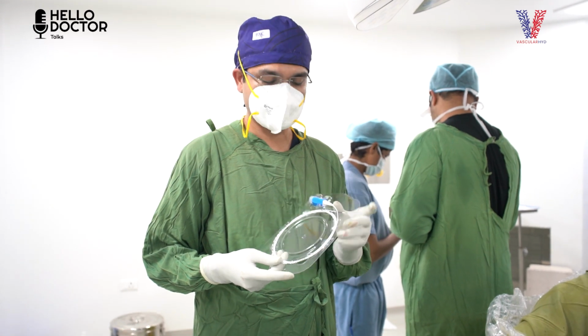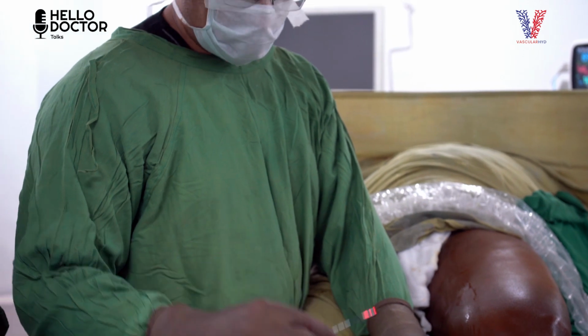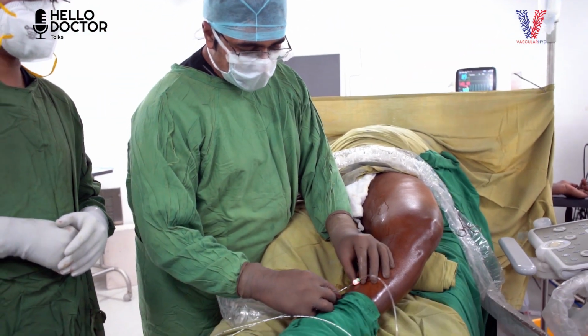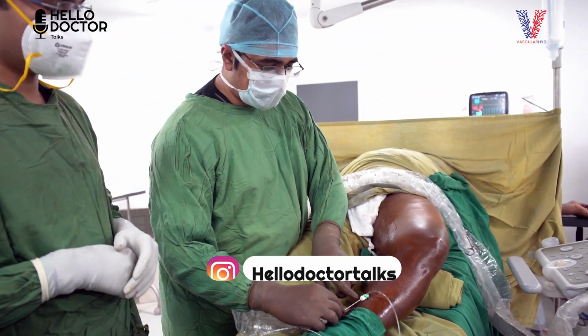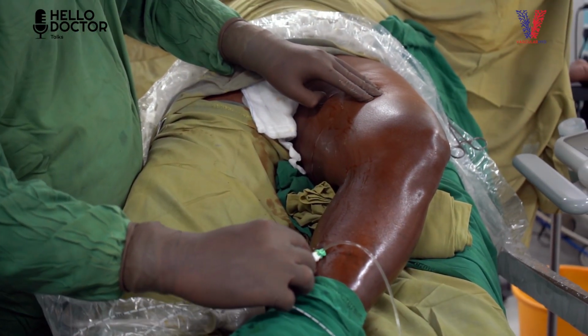The laser fiber. So this is from the Biolitec company. This is the marker light, which will guide us to know the position of the tip of the laser fiber, which you can see here. Okay, you can trace it.